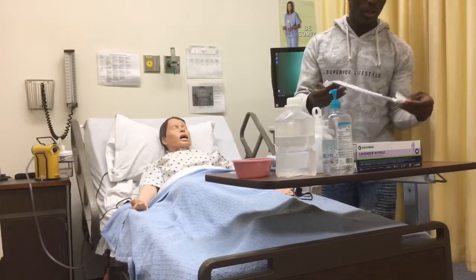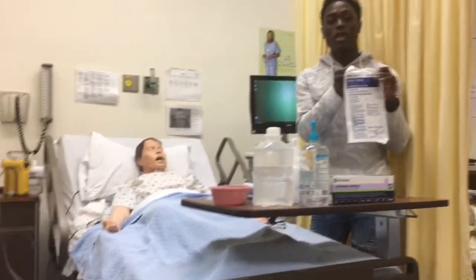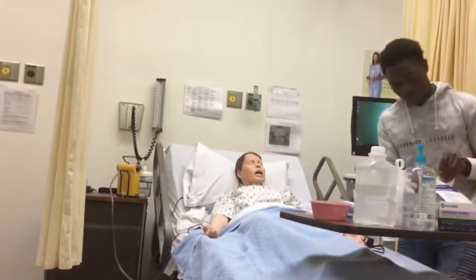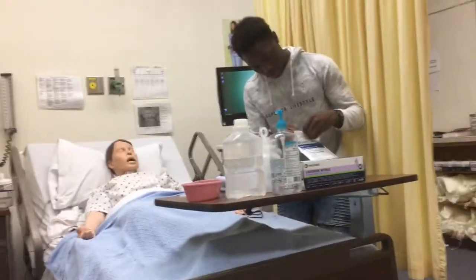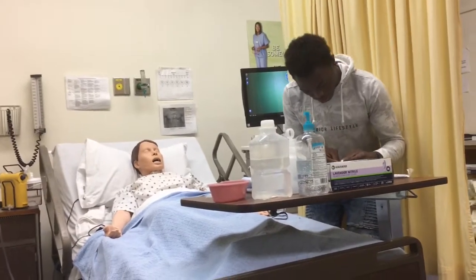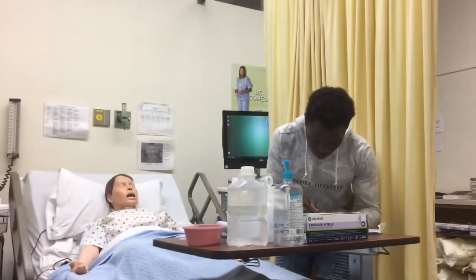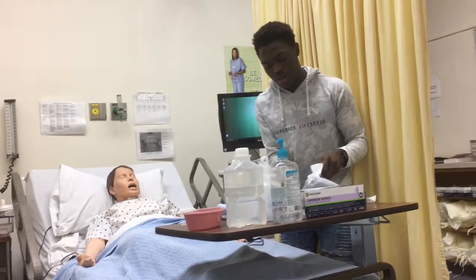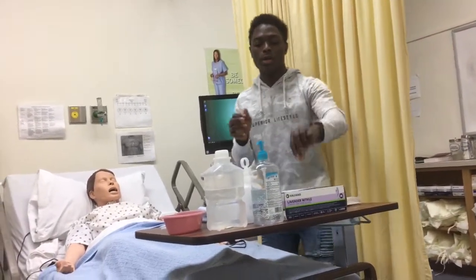Next step is going to be to open your tube kit. And one thing you should know is that this procedure is a clean procedure. It's not a sterile procedure. So open my catheter kit. Now I can go ahead and put on my gloves.